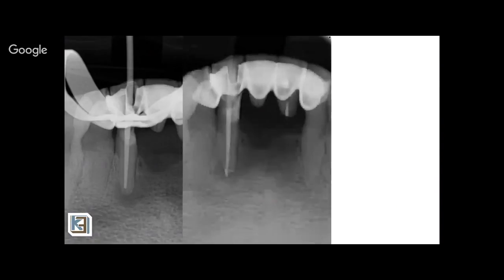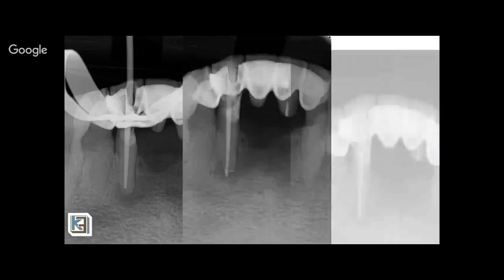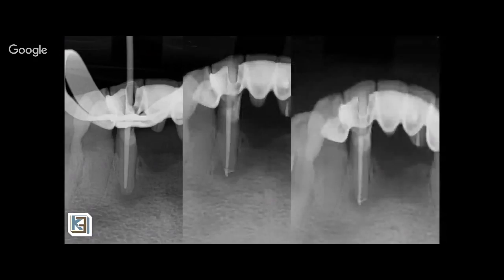This was my master cone after I was able to drill through it and get to the canal and find it. This is the final outcome of the case.